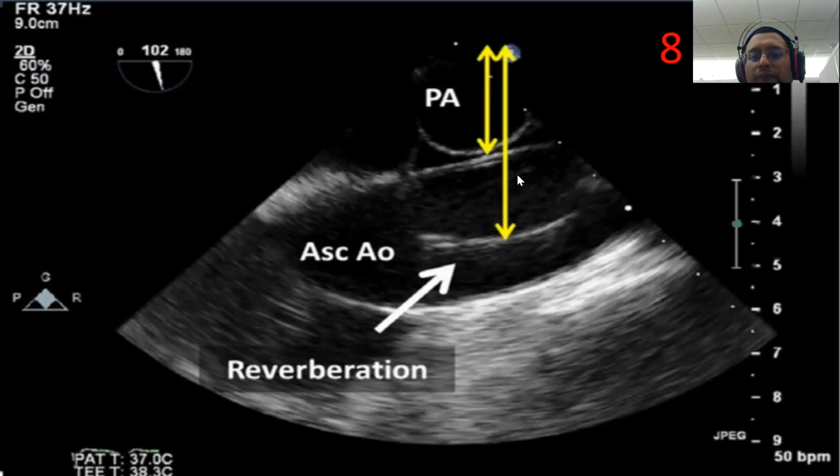So one more time, this is the source of the ultrasound, it goes one. That is the first image. It goes one, two, then it interprets that as a second image. And the second image, as you can see, the distance is twice that of the image at the beginning. So if you see this in your TEE and you see a line here, just make sure that it is not a reverberation from the line on top there. Is it clear for this one?